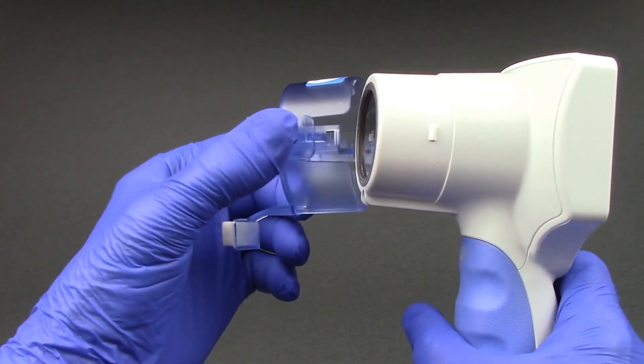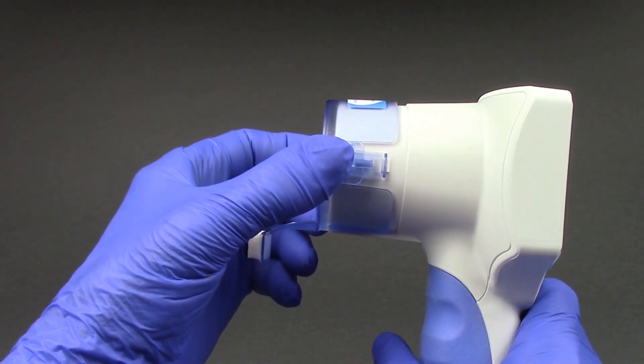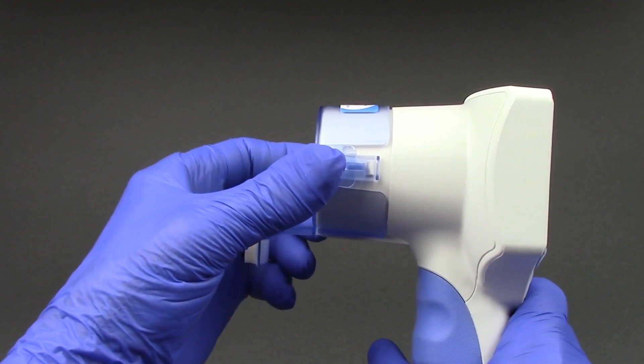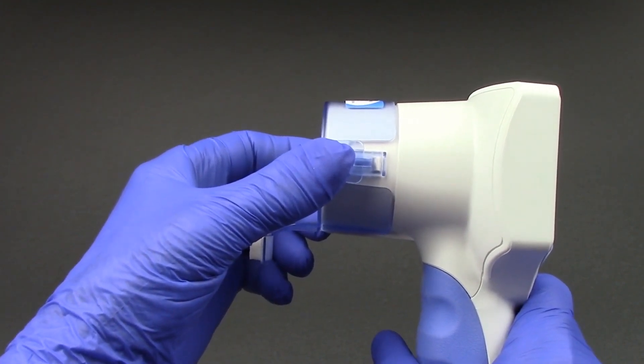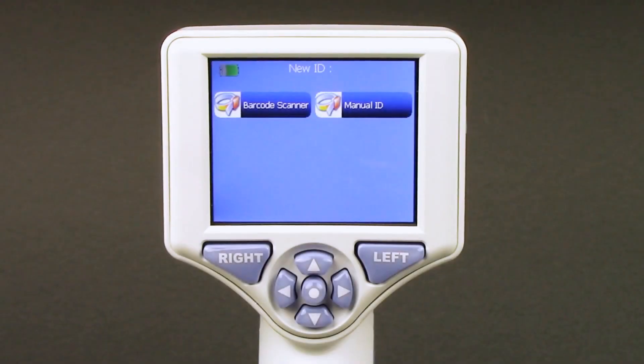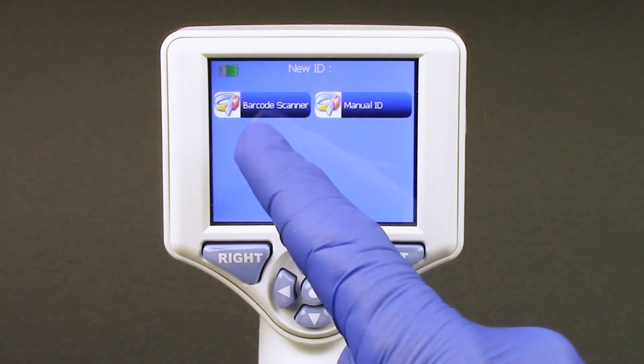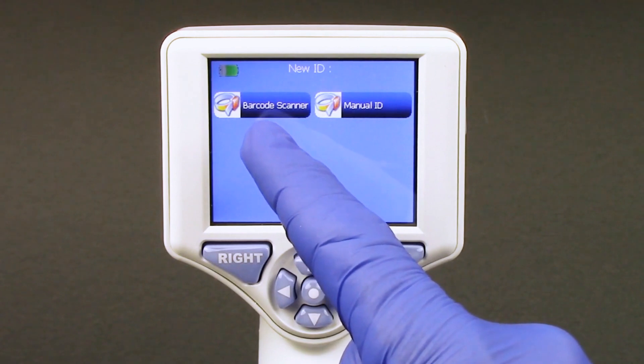Gently squeeze the smart guard side tabs to position onto the NPI 200 pupilometer. There will be an audible click when the smart guard is properly positioned. Prior to the first patient measurement, the patient ID must be entered properly into the smart guard using either the barcode scanner or manual entry of the patient ID.